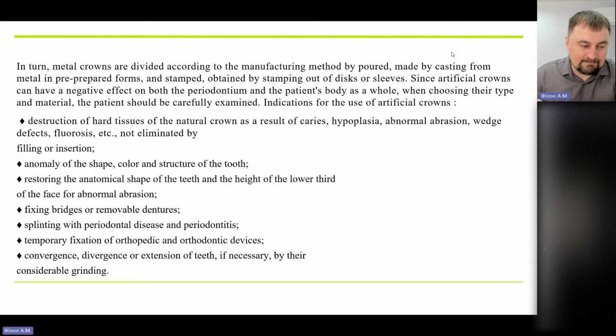What else? After examination, you have to do a photo protocol. What is it? Photo protocol. You have to take a lot of photos of the teeth of the patient, of the face of the patient, and all these photos are going to give you a lot of information, because when you examine the patient in your clinic with the instruments, you can see many things, but maybe you're not going to find all the problems.